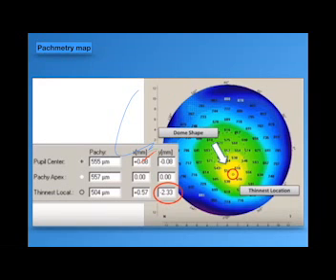Okay. Fine, thank you sir. You're welcome. But as we said and answered with Dr. Ezzat, if you find the scar and you can diagnose the suspected or expected cause of this scar, it is not a scar of corneal protrusion, it's not hydrops, it's not a scar after keratoconus. If this scar is post-traumatic or post-surgical, you can go for refractive surgery if the other factors allow you to do that.